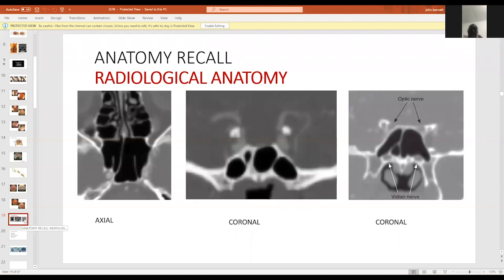So the CT scan for each patient is valuable. You should look for the septum that you find inside the sinus, because this will delineate compartments. If you don't analyze well, you may get into a small compartment and think that you are inside the sphenoid sinus. And if you think that you're inside the sinus, usually you go laterally. And this is how you can injure the ICA and have bleeding, sometimes fatal.